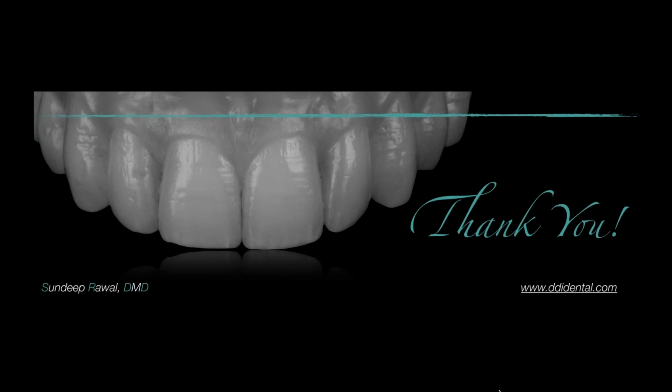The key is you need to make sure that you calibrate, or you make sure your settings for your data acquisition are in sync with your software. So if I'm using Implant Studio from 3Shape, Implant Studio has parameters that the CBCT needs to be taken at: the voxel size, the amperage, the exposure, all that kind of stuff. You need to make sure that you're taking it at the manufacturer's recommendations for the software you're using. So there's just a little bit of things that you need to look at and make sure.